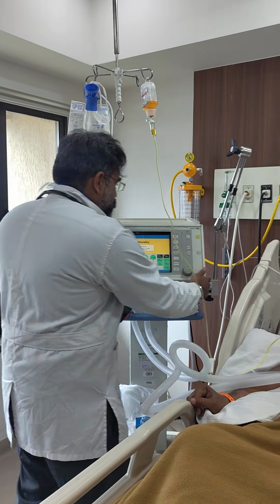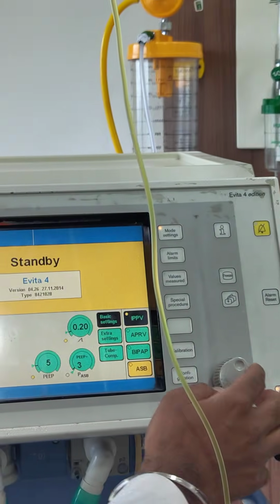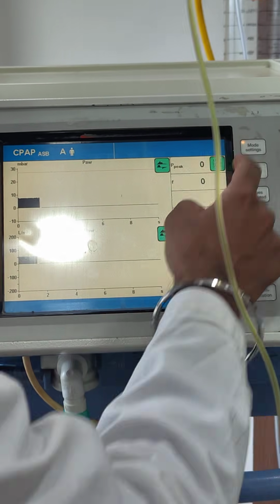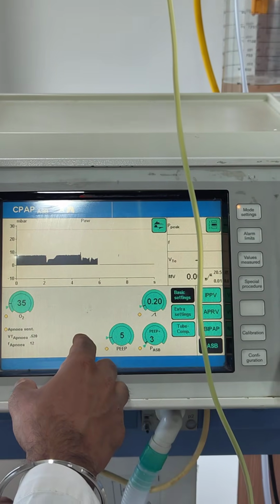Okay, so in this case, if I put pressure support, what is going to happen? I'll show you. If you put pressure support on, and I start it, you still are going to have very large tidal volumes probably, which indicates huge swings in pressures. Have you applied? Yes, sir.